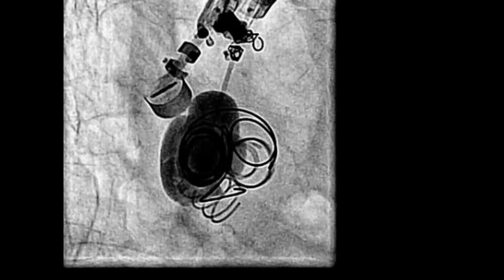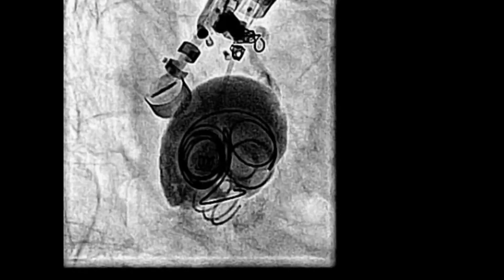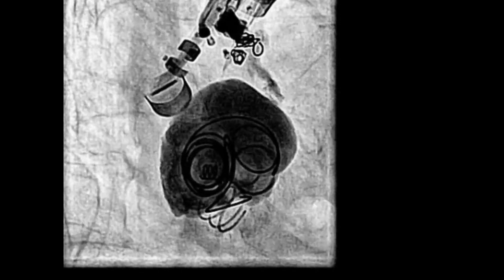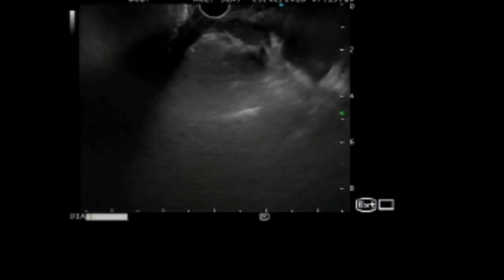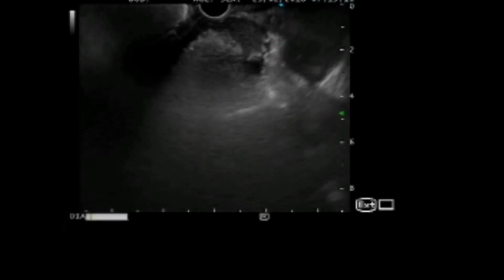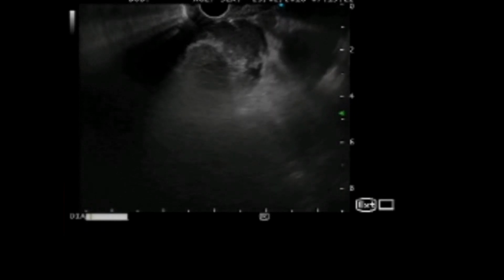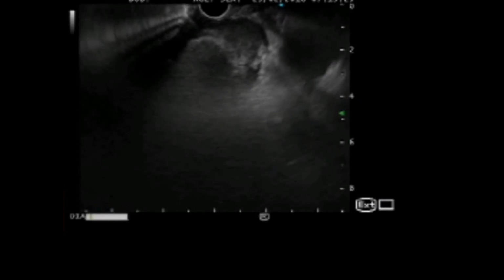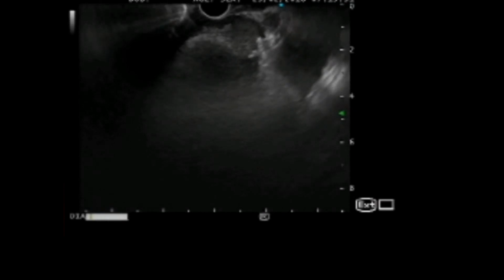There is a risk of needle stick to the target lesion and risk of premature catheter plugging as well, but here the procedure is being done through the transesophageal route, so the esophagus acts as a board, so less fear of needle sticking. You can gently remove the needle and place the transducer in the lumen of the esophagus to provide tamponade so that the risk of bleeding is less.